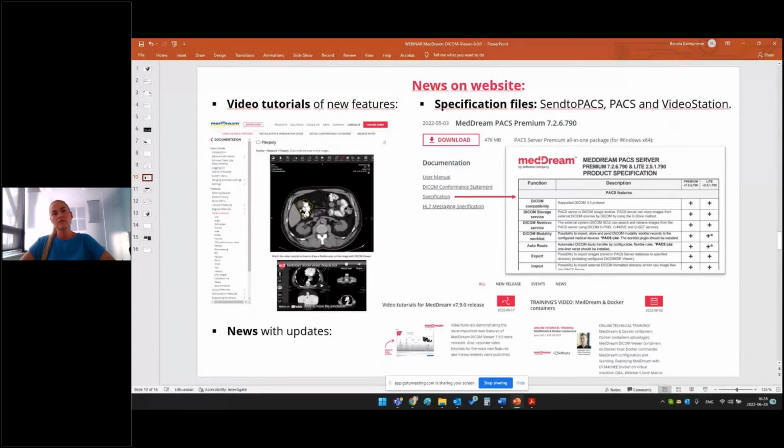As I mentioned, we don't want to spam a lot, so I will put what's new on the website, to which page to pay attention, small news.